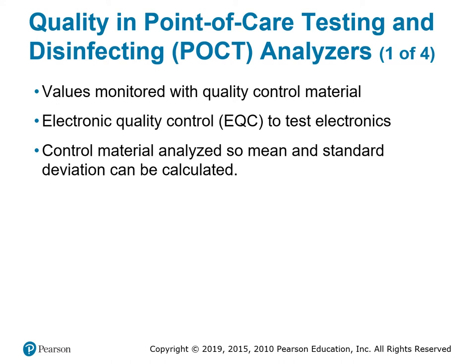Now, based off the calibrations, knowing the mean, the average reading of this device, and knowing what we need the specimen to read as, that's how we'll make the determination. Now, if we need a specimen to read one thing and it reads something totally different, and whatever the reading is is not in conjunction with the standard or the mean, then we know, hey, this device needs to be recalibrated, okay? Because there's no way this person's levels could be this high and they're functioning like this, or vice versa, have their levels be that low and they're functioning like this.